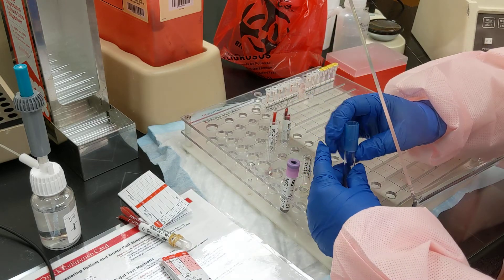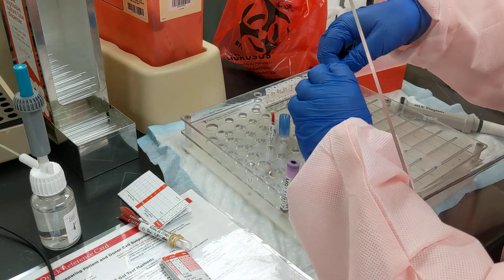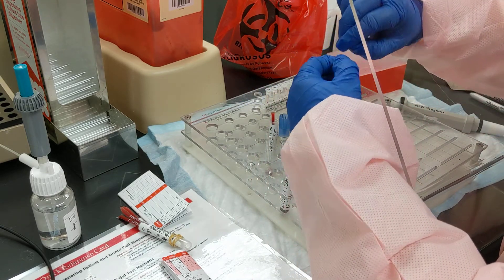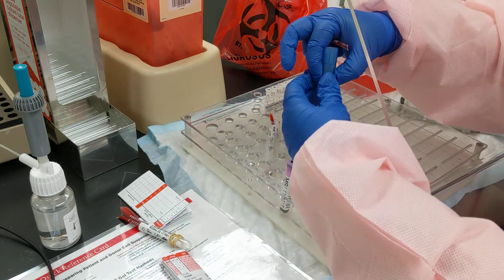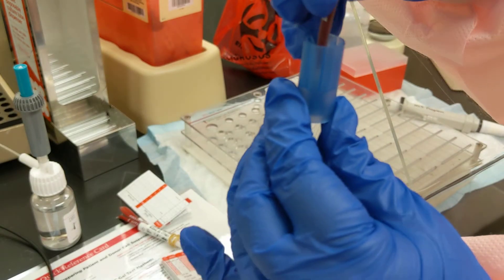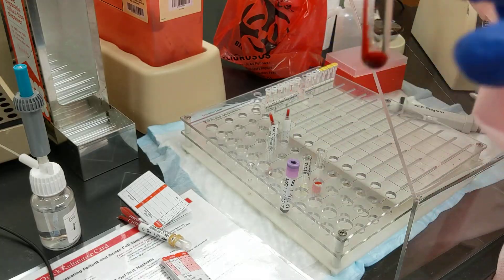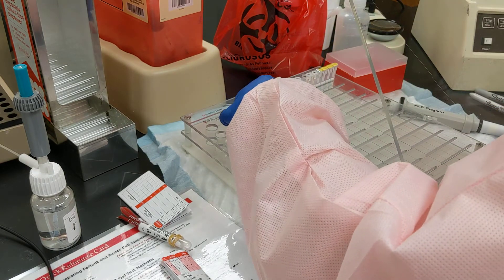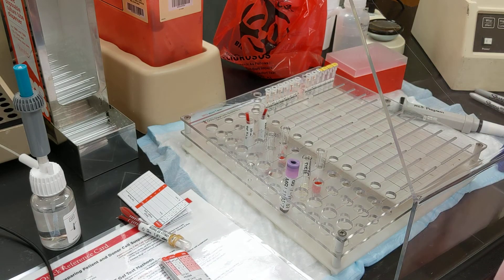Same thing for the second unit — you pop it on there, take a segment, and if you're behind a shield you can twist; otherwise use scissors. You pop it in there, and now you've got plenty of blood in the bottom to do with what you need. And that's how you use the hemotype segment device.